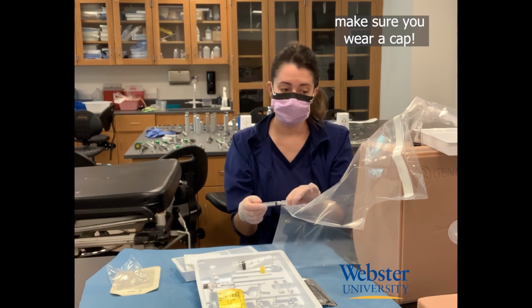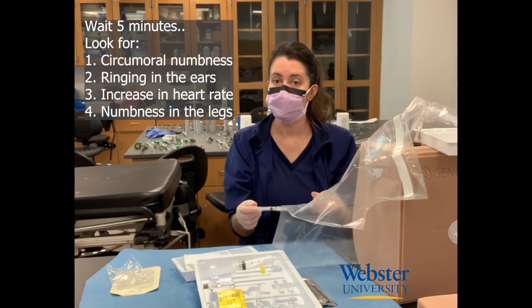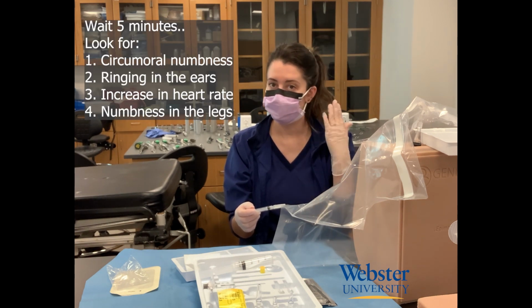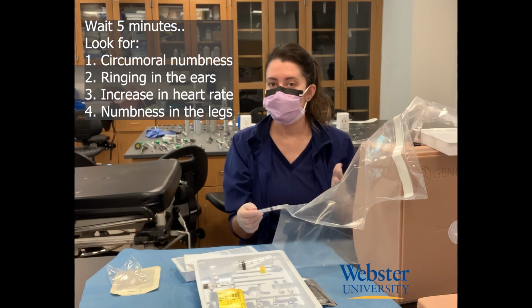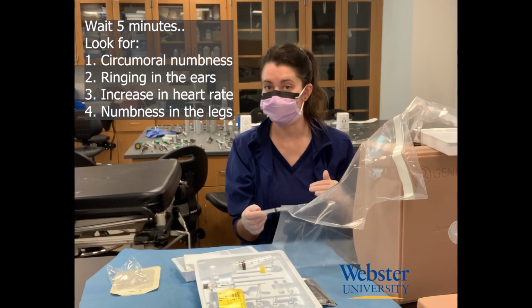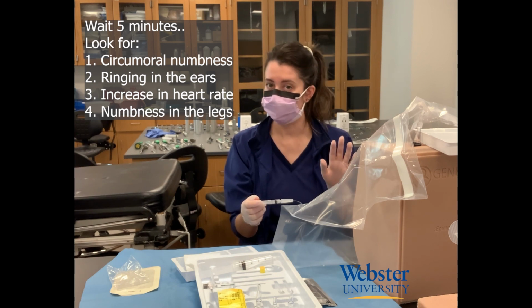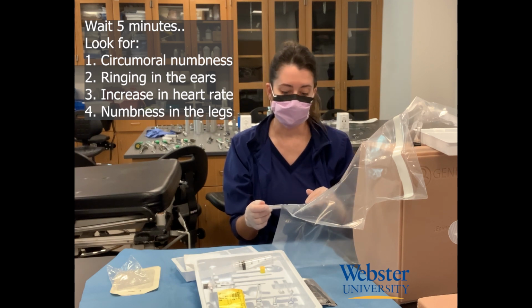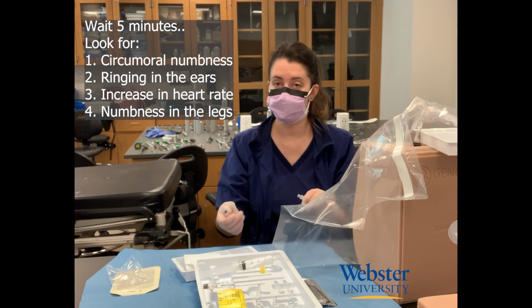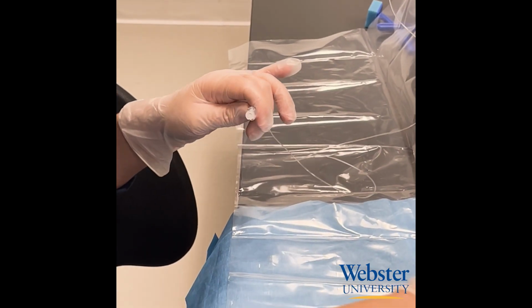After pushing your test dose, you need to wait at least 5 minutes to make sure there are no signs of an intravascular injection. These signs are circumoral numbness, ringing in the ears, and an increase in heart rate. These signs can be seen as early as 30 seconds and can last up to 5 minutes, so also allow enough time to make sure this hasn't occurred. An intrathecal injection would cause numbness in the legs within 3 minutes. As long as there's no signs of an intravascular injection or intrathecal injection, you can bolus the epidural.